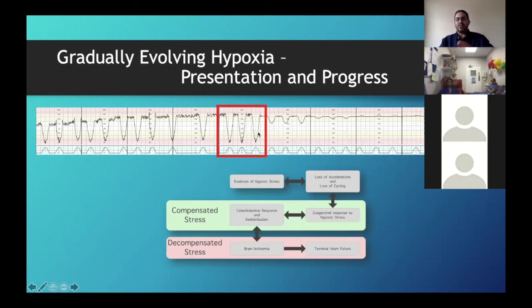Okay, there are 2 ways that you can look at this. You can either take a deep breath, slow her pushing, stop her pushing, give her terbutaline, do all of that, and then start. Or you can start panicking and have to deliver this baby now, with a high head, that she's not yet started pushing, she's not that experienced, she's not going to push that well, and you're going to end up with a cesarean section. So the reality is, as long as STAN has not alarmed, you actually still have time to improve the trace. If STAN is alarming, you still have time to improve the trace, but that's not a very long time. You have 20 minutes to make a significant improvement.